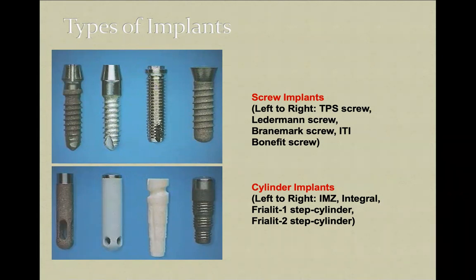But again, I have experience, more than 15 years, with that kind of implant. I don't like it. I'm not using this kind of implant. It's better to use bone grafting. It's better to place implants deeper. I'd like to avoid that kind of implant.